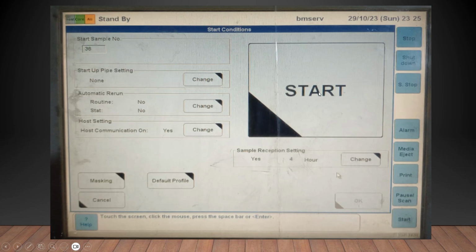Like how the sample is picked up, CFAS also will be picked up like that only. Means it will first go for a preparation. If it is in sampling stop, it will go for a sample scan. During that time it will check whether, in the 80 and 81 positions, we have kept the required reagent or not, and then it will recheck it. After that it will do the calibration. Now again for glucose, the calibration time is 7 minutes, like how the sampling time is there. So based on that it will complete it.